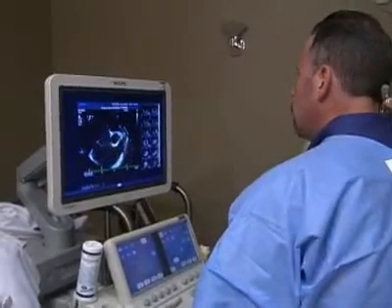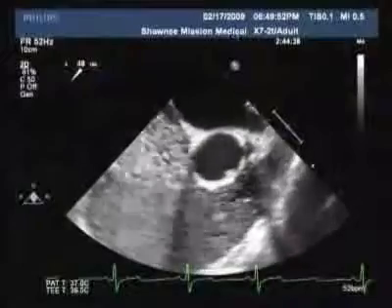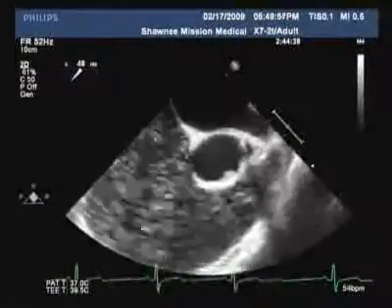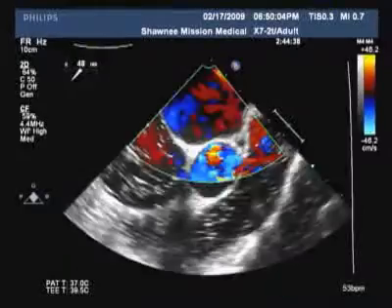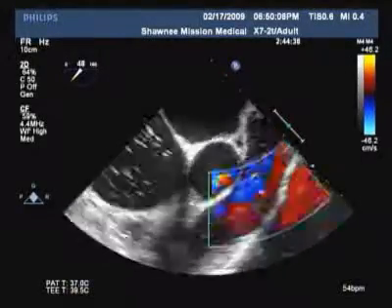No. We're going to look at the pulmonic valve down here in the bottom of your screen on the right. A little bit hard structure to see, but you can see it down there. We just got a little bit more bubbles in there because we gave her a little bit more medicine, to try and keep this young lady comfortable. We're going to put some color down here. Jessica is, and she's going to kind of show you where that pulmonic valve is down there. We'll see if there's anything going across there.